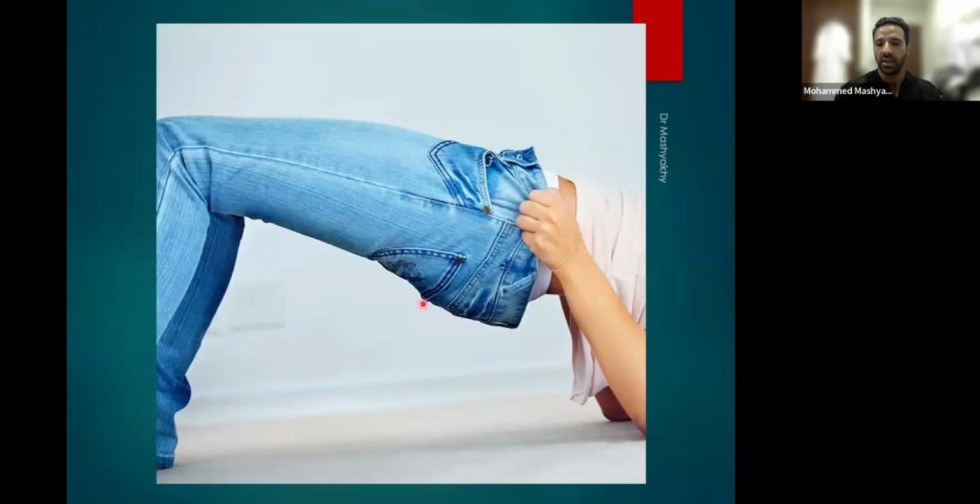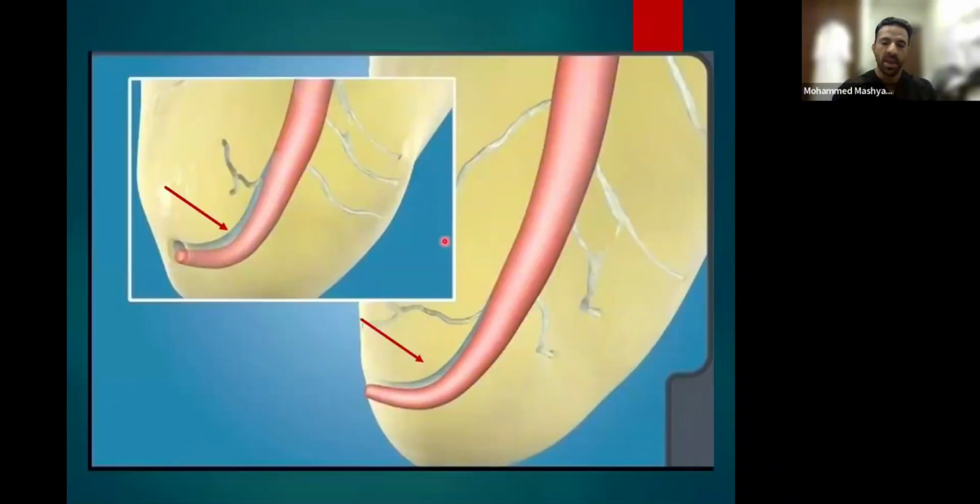It doesn't stick in the right place. So when you think about this one and you think about this one, it is almost the same. We need the fit to come from the apical part, exactly. We don't want the fit to come from the middle or from the coronal. And this will happen by having a 04 taper or smaller taper, not the big taper.